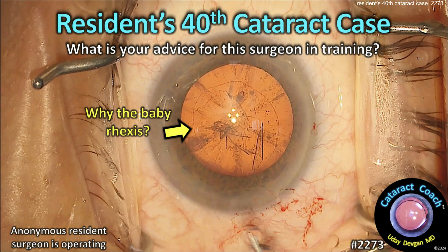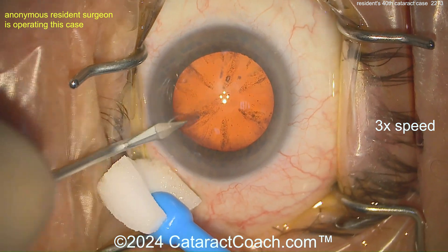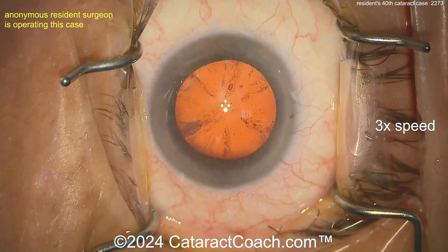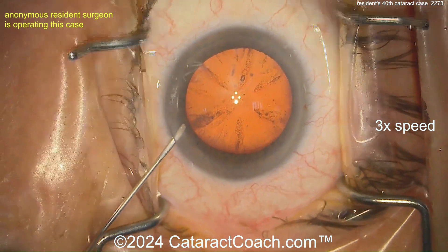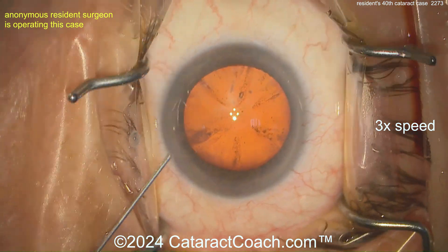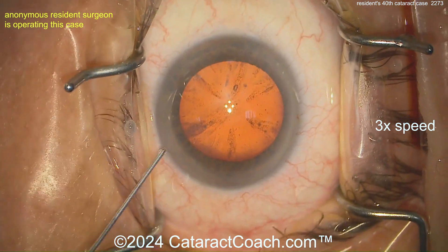Cataractcoach.com — a resident's 40th cataract case. What's your advice for this young surgeon in training? It's July here in the USA, and that means new senior and even junior residents are starting to do cataract surgery. What can we do to give them advice and encourage them? This video is at 3x normal speed, which is why it looks a little jittery.